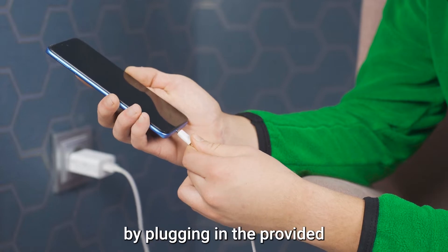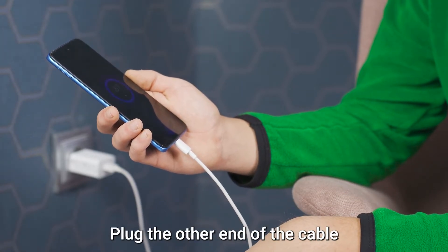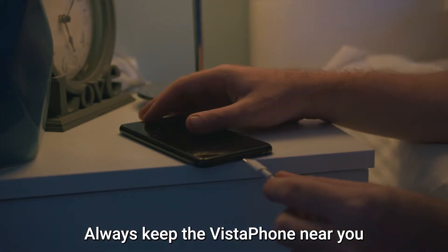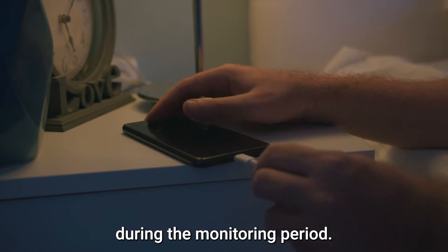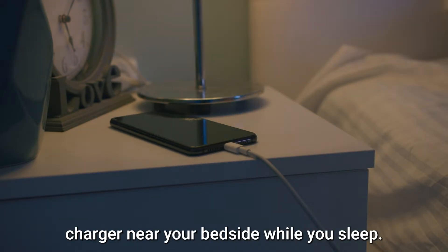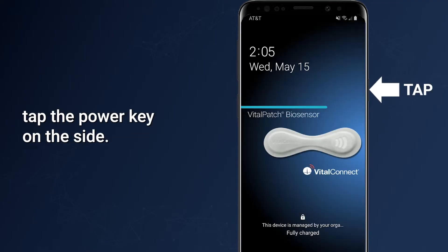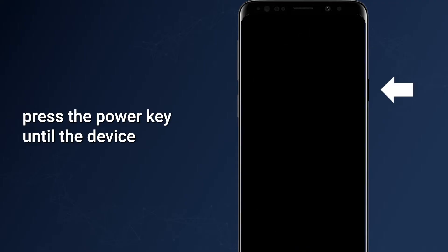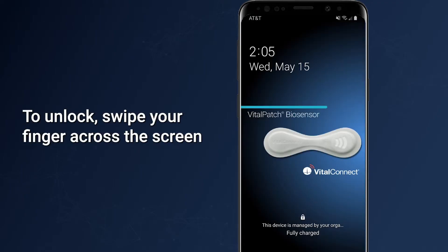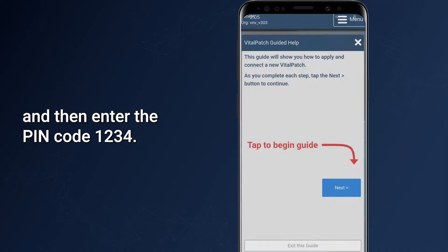Charge the Vistaphone by plugging in the provided USB-C charging cable. Plug the other end of the cable into the charger. Always keep the Vistaphone near you during the monitoring period. Keep the Vistaphone plugged into its charger near your bedside while you sleep. To check if the Vistaphone is on, tap the power key on the side. If the phone is not on, press the power key until the device vibrates and the screen lights up. To unlock, swipe your finger across the screen and then enter the pin code 1234.